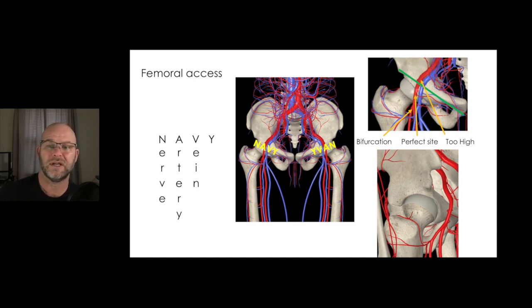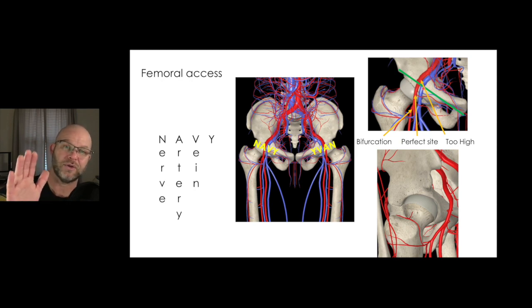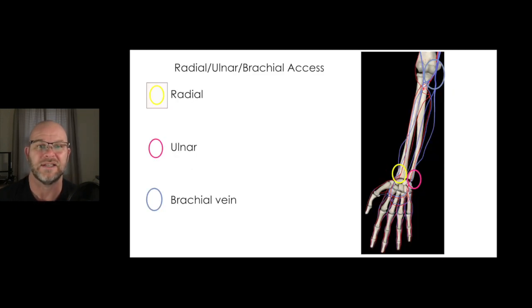But once it goes above that inguinal ligament, now you're going down toward the retroperitoneal space. So a high stick means it was stuck above that inguinal ligament, which can't be seen on x-ray, but it is inferred based on the femoral head. And with angiography, you can study that too. This oblique view in the bottom corner shows how those vessels surface up to that plateau. They're on the plateau over the femoral head, and then they go back down into the retroperitoneal space if you're heading inferior to superior. So when you talk about radial access, then you're talking about a little bit safer approach.